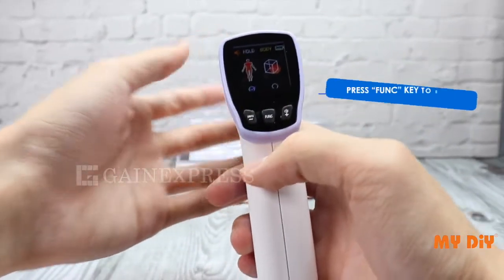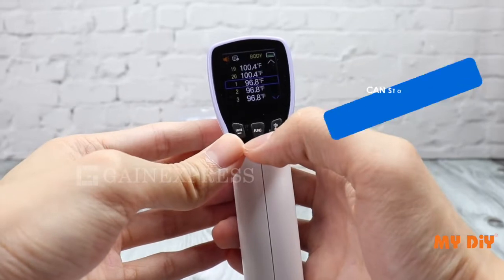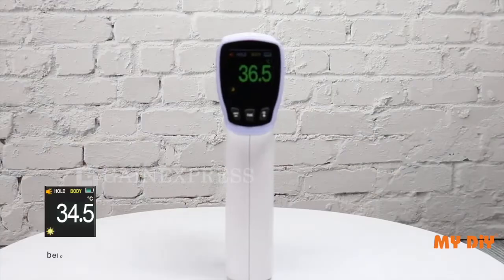Press the funk key to enter the measurement mode selection. You can select body or surface temperature. To view the stored data, press the funk key four times. You can store up to 20 data. Pull the trigger to return to the measuring mode.